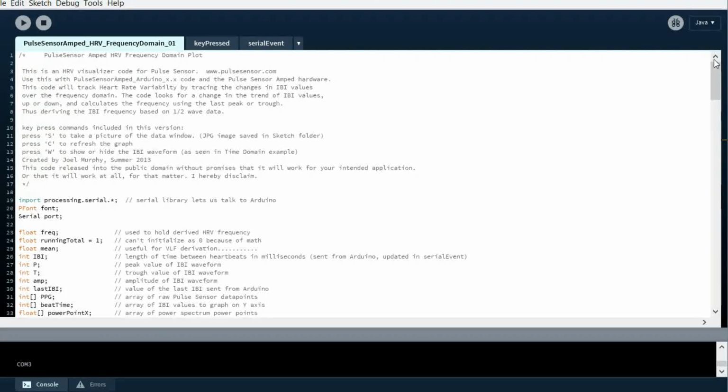Although, I didn't really like the way the application was behaving, and I'll show you in just a minute. It prints dots all over the screen, and it's got a running waveform, which is visually appealing. It looks cool, but it makes it difficult, in my opinion, to analyze the waveform because it's constantly moving. In my opinion, if it's stationary, you can actually get a better idea of what it looks like. Of course, you could always take screen captures and do the same thing.